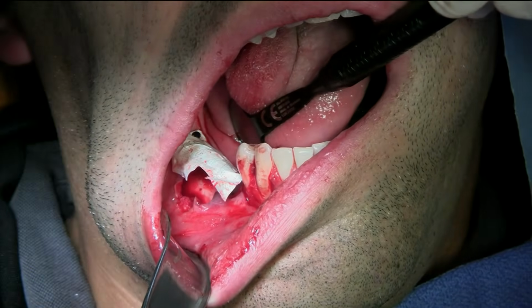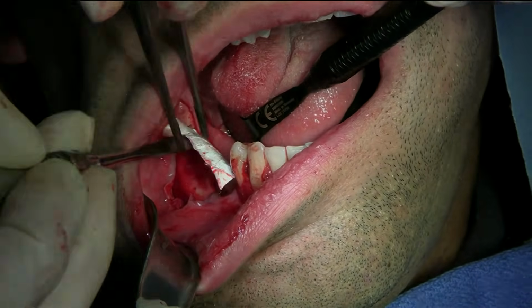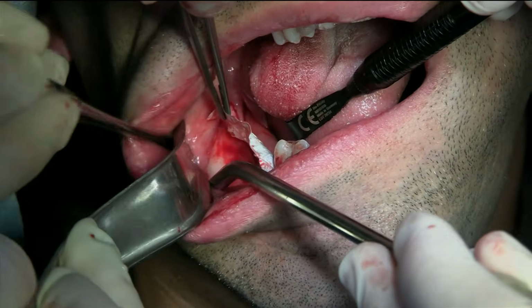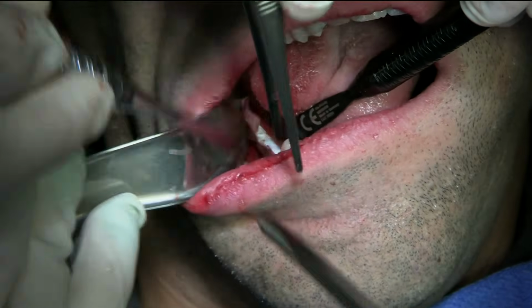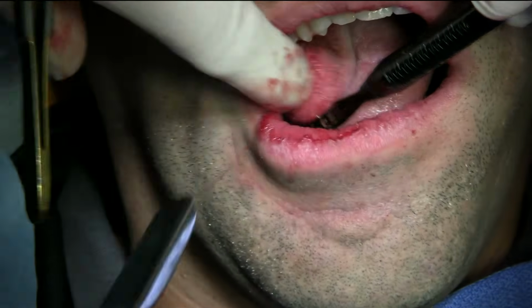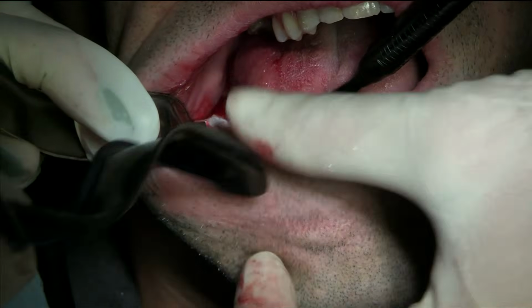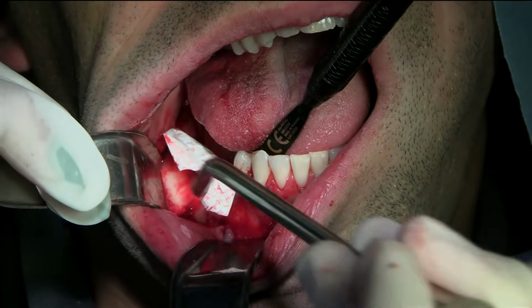I have a plier here which has no teeth, so that's good for the membrane. It doesn't traumatize the membrane, and you've got to go here under the flap with the retractor. You've got to do the retraction under the flap. Okay, like that, and then we need another retractor. That's one. There's two in the front. Okay, perfect.